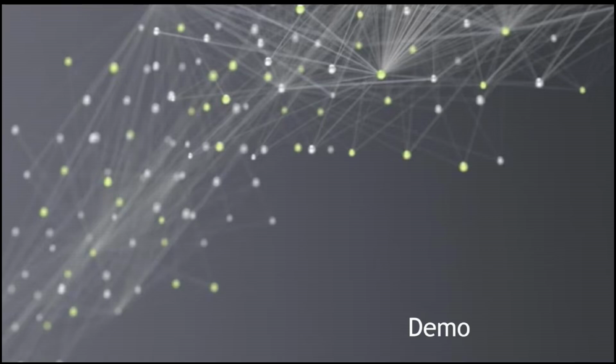I'm making a digital twin of vascular in upper arm from ultrasound images. So is there already a data set of ultrasound vasculature that I would build off, or what would I have to do?